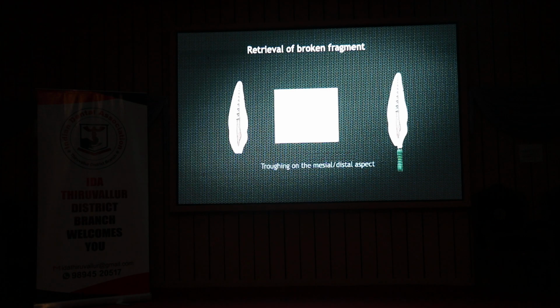If the canal is larger, you can probably try to insert it between the broken instrument and the canal wall, and then try to pull it out. If the instrument is smaller, it can come out. If not, no. I'm sorry again, the tooth picture is not seen, but you can see the ultrasonic tip.